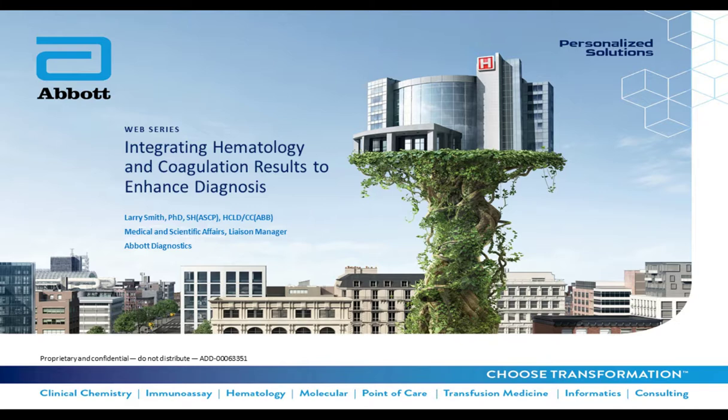Either you'll get a prolongation in your collagen epinephrine closure time or your collagen ADP closure time. And this may be sufficient as long as you're correlating it with the patient's status, et cetera. Very often, aggregometry may be done, but it would require that it be done right away, and so you really couldn't wait. So if you were looking for something a little more complicated, platelet aggregometry would be your next choice. But I think just a platelet function screen, if it's something very simple that you're looking for, should be sufficient.